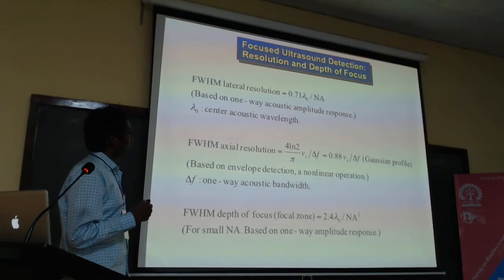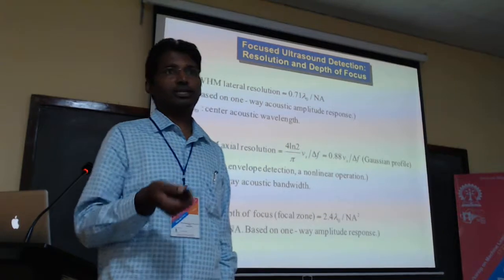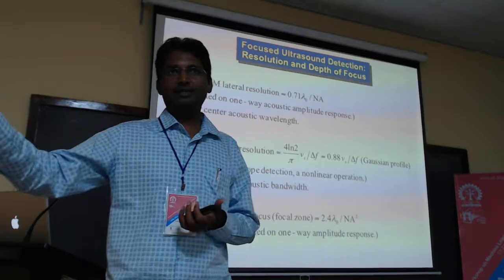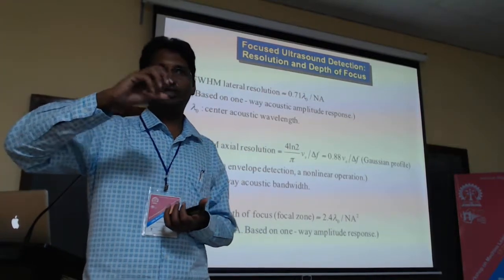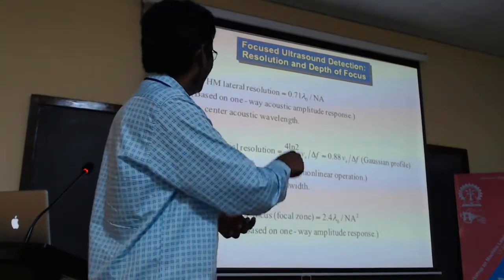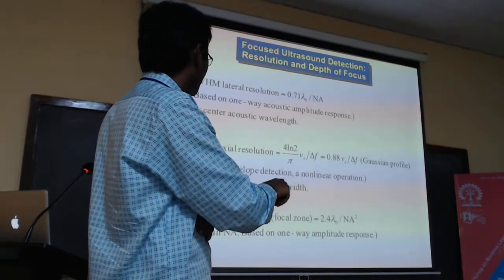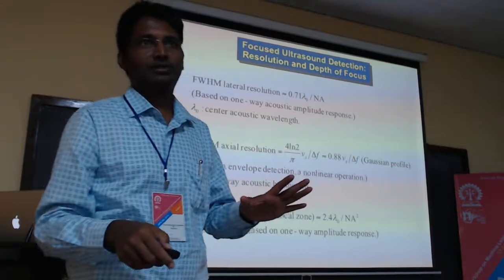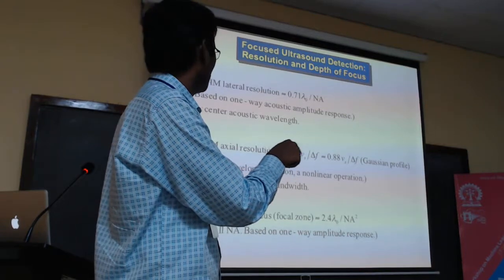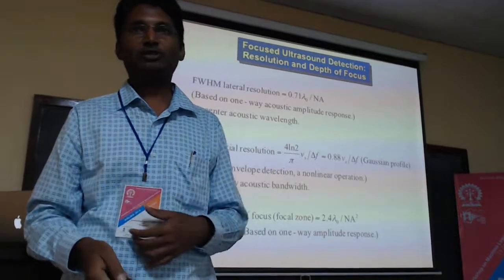Now, the one thing I have not talked about on the detection side is focused detection. Till now, what we have talked about is that a sound wave is generated and you detect it. Of course, you can also focus it to a particular location so that you only detect the signals coming from there. That also has a similar effect on resolution. Similar to what we talked about, there is the lateral resolution and the axial resolution, depending on the focal zone, again similar to ultrasound. So it's all based on simple ultrasound, where the lateral resolution depends on the aperture, and the axial resolution depends on the frequency. That's typical in ultrasound.